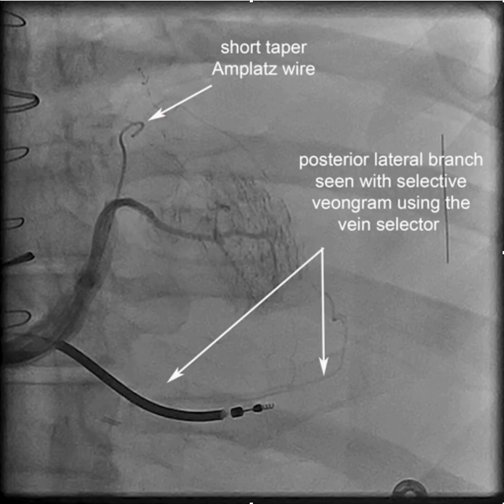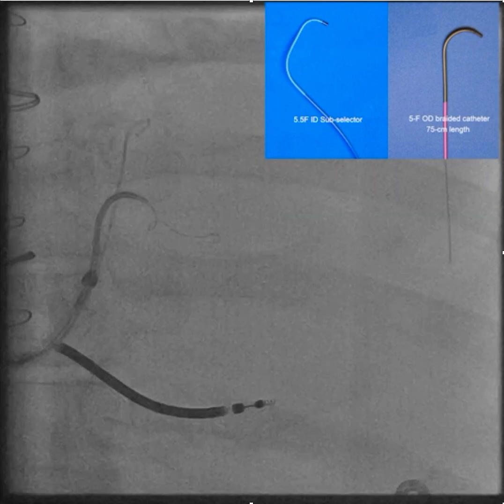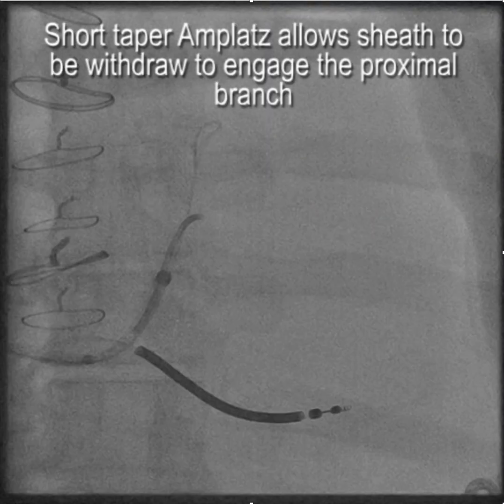The branch was quite small, and we considered whether we could do venoplasty — that would certainly be an option if this posterolateral branch didn't work out. But you'll notice that the wire just dead-ends here, so the snare wasn't an easy option, and venoplasty, although possible, would be a bit of a struggle.